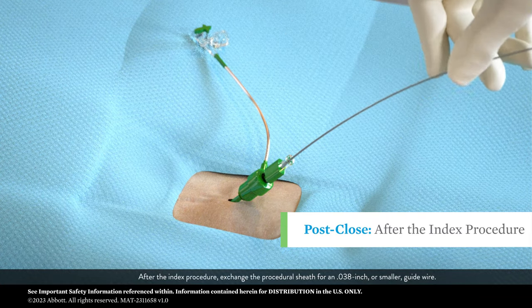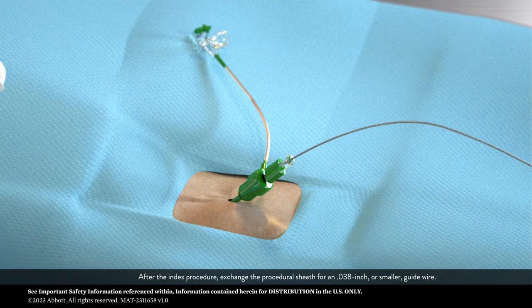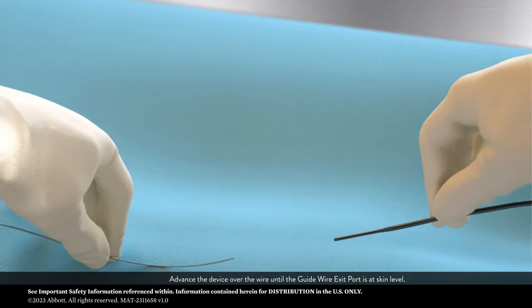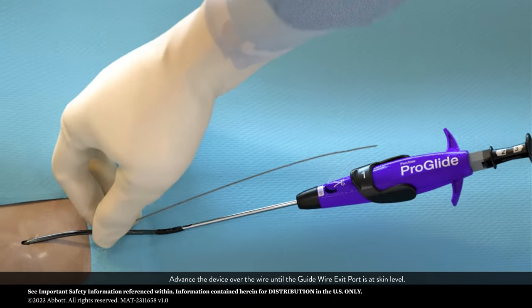After the index procedure, exchange the procedural sheath for an 038 inch or smaller guide wire. Advance the device over the wire until the guide wire exit port is at skin level.